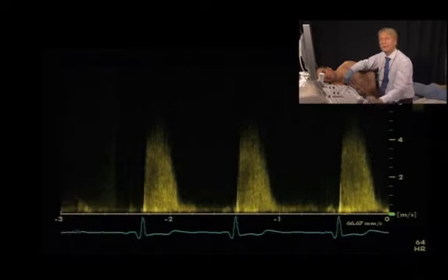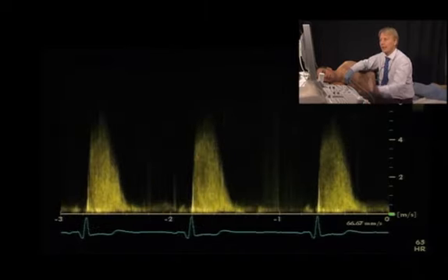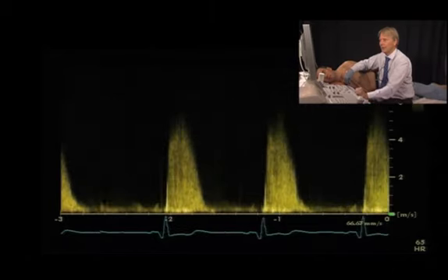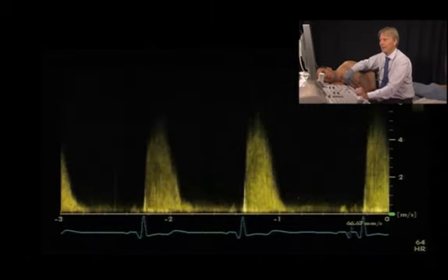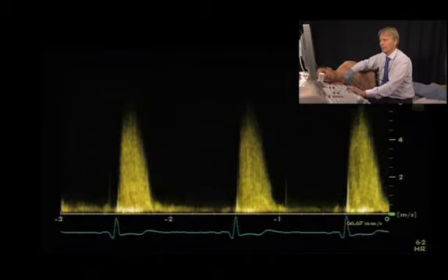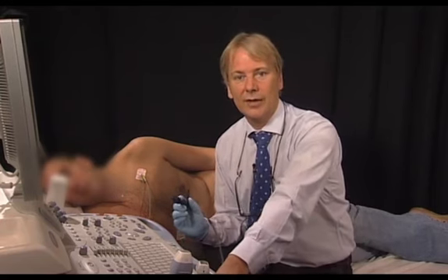It's very important to also listen to the signal, because this gives you more information where you actually are than sometimes just looking at the image. And here you can see that the maximum velocity is now higher than what we had before. And here we have a signal now which is almost 6 meters. So, in conclusion, very important, first to put the patient in a right position as far as possible. Second, to listen to the signal, small motions, and to try more than one transducer position.